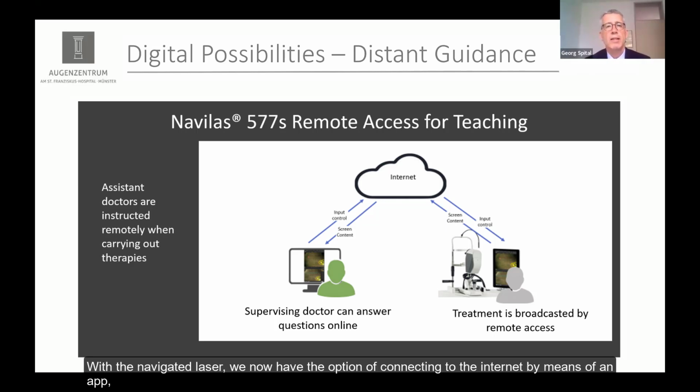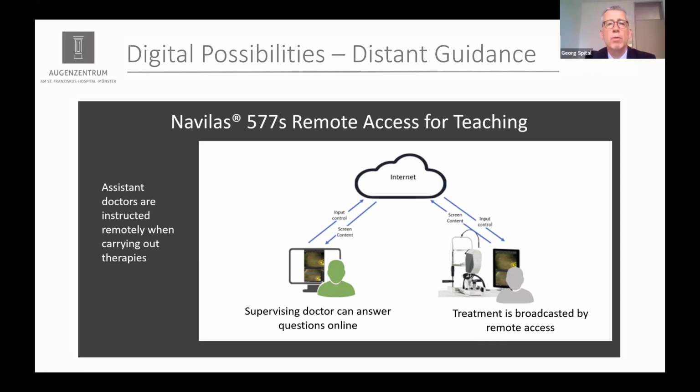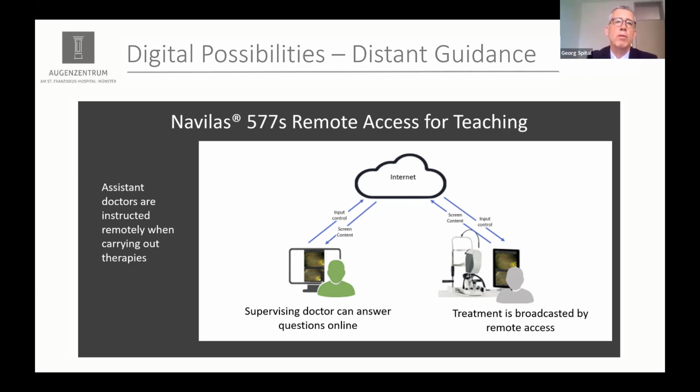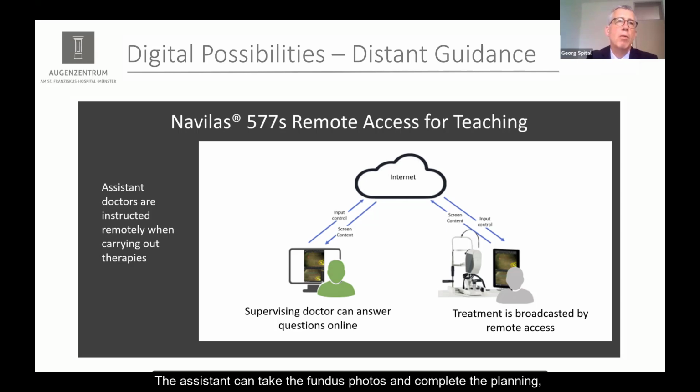With the navigated laser, we now have the option of connecting to the internet by means of an app. For example, I or another senior consultant can be involved in treatment by an assistant. The assistant can take the fundus photos and complete the planning, for example, while I can see live what is being done, and the assistant has a headset on so that they can ask questions live.